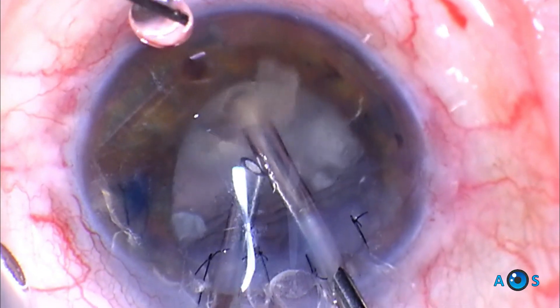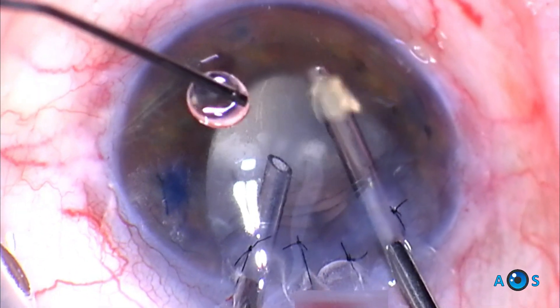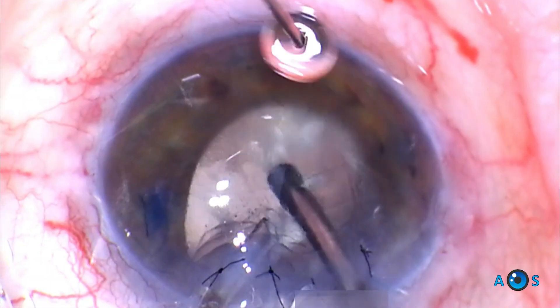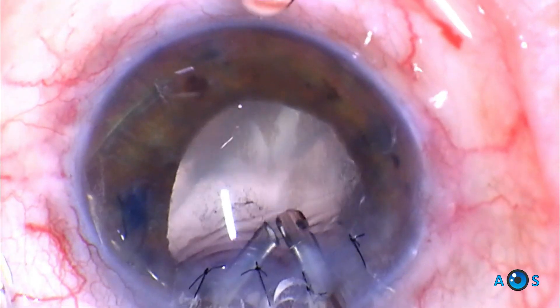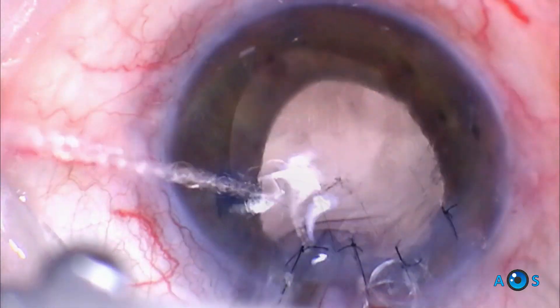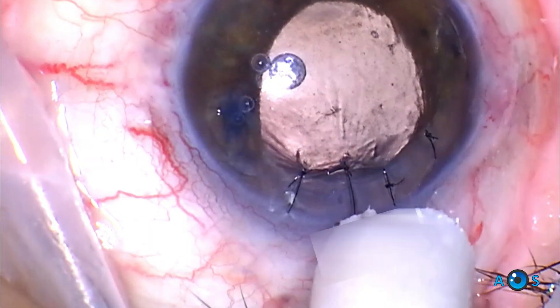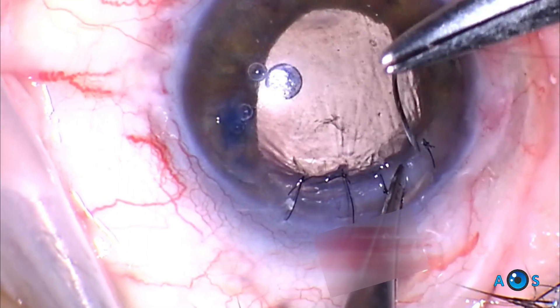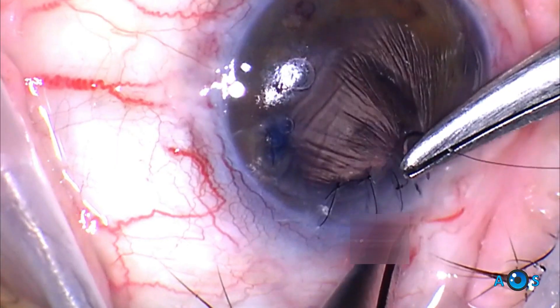The surgeon may then switch to IA-cut mode to remove any residual cortex or epinuclear material. The anterior chamber is now clear of vitreous or any residual cataract material, and we are now ready to finalize the corneal suture.